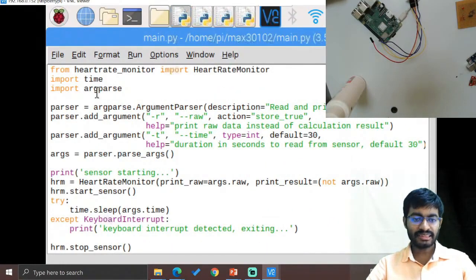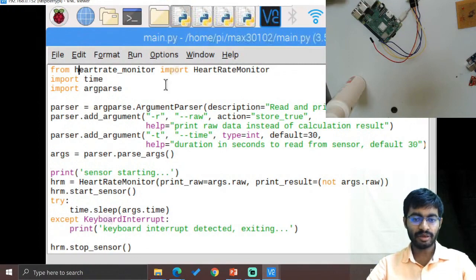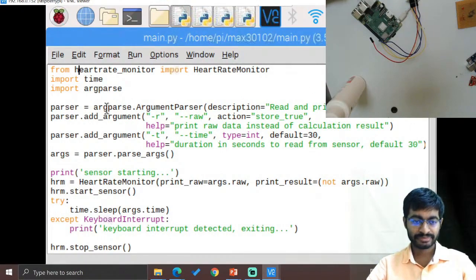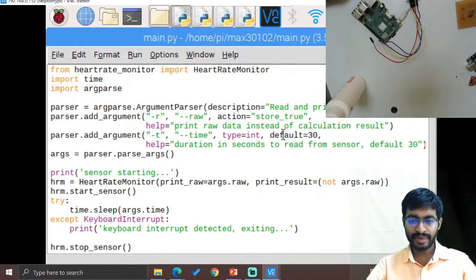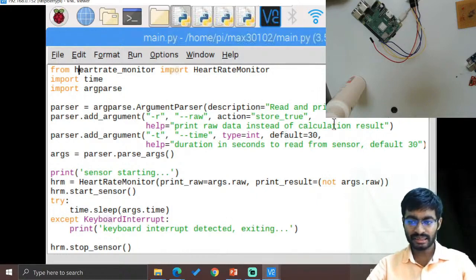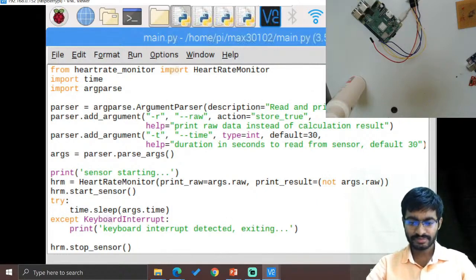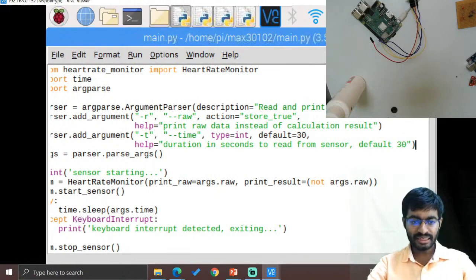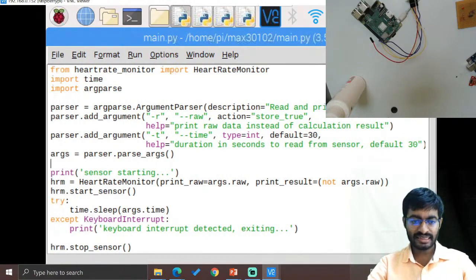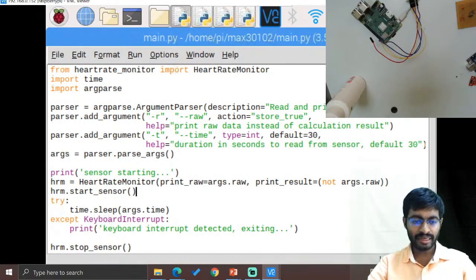Now this is our main code. From heart rate monitor we will be importing that heart rate function, and the four arguments will be applied to read that particular data in the form of print section. Then after that, the sensor starting from that, the raw data will be obtained over here.